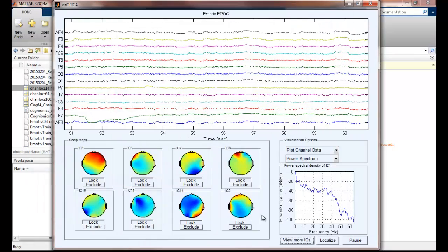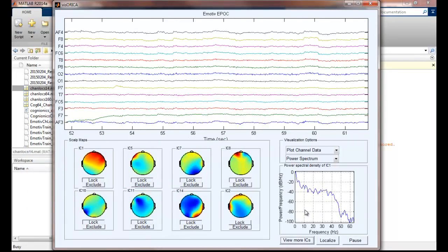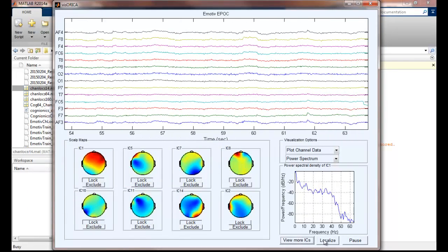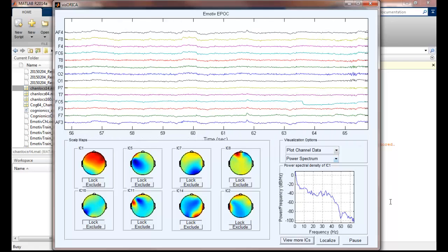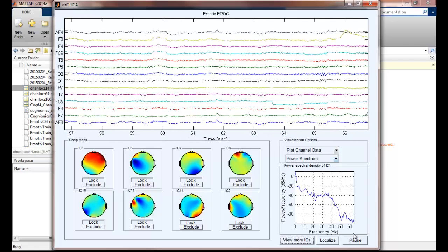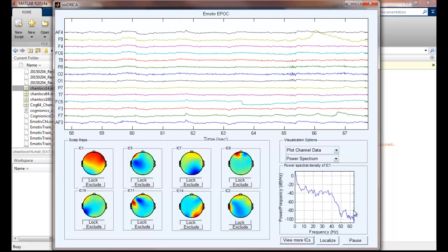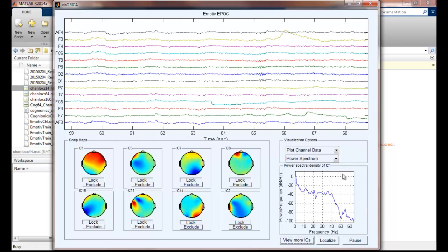And the bottom right panel shows the power spectrum density of the selected IC. It is computed over a 5-second sliding window.